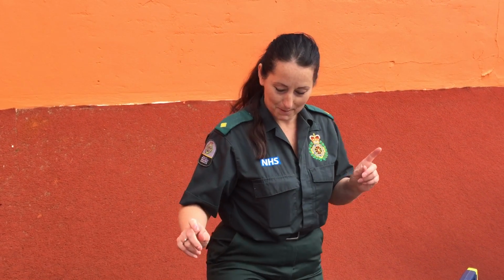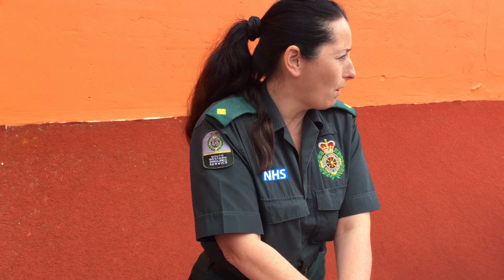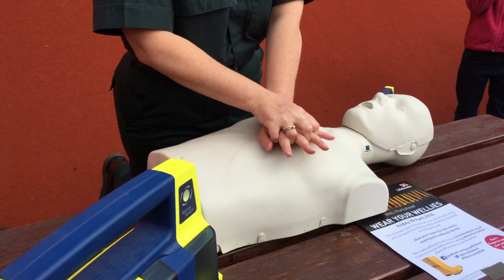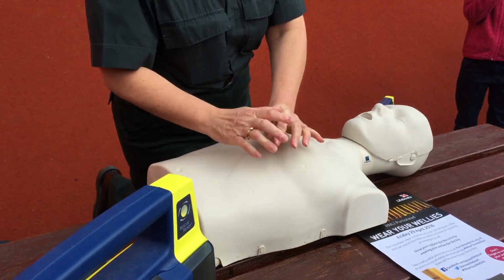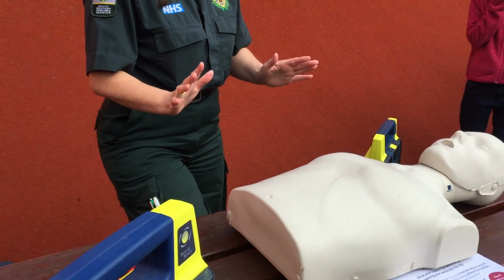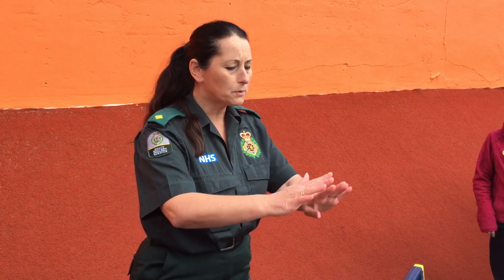If they're not breathing, and at the moment you haven't got your defibrillator, what do you think you're going to do? Yeah, already done that. Oh, you've already done that. Yeah. Start CPR. This is going to be a bit difficult on here, but you would start your CPR. So you will be on the chest doing your compressions till somebody comes back with the defibrillator. As soon as they come back, you need to expose the chest, because there are things that you need to look for on the chest, which I will go through in a minute. But you need to expose the chest.